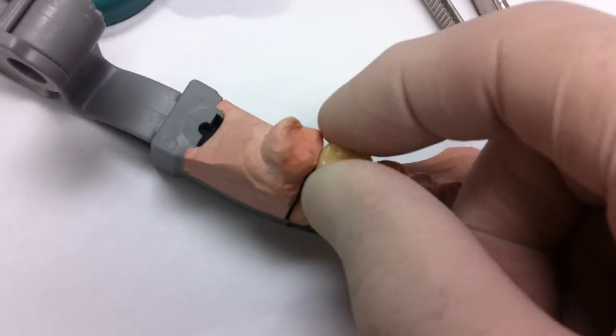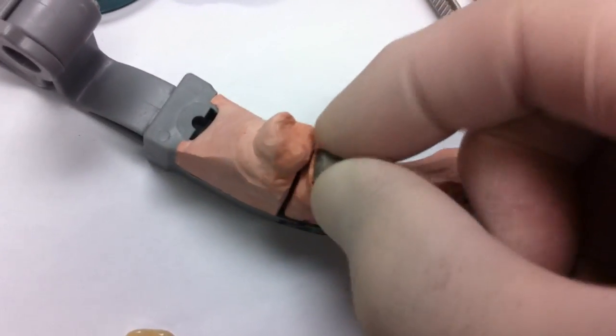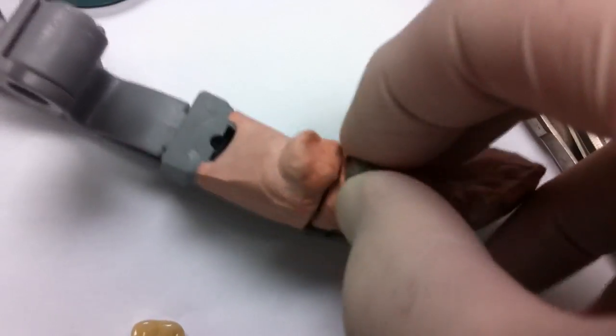Now we have a patient right beside us and we're about to do this all in one shot. It will be difficult because I'll be watching it through my camera.